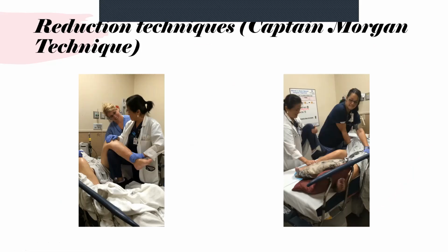And our A&E specialist here, I was actually supposed to put a name, but she's quite prolific on YouTube, and she does a lot of these things in the emergency department. Hopefully I'll look through and try to find the name again. We're going to look at something called the Captain Morgan technique, because you stand like Captain Morgan on the rum bottle. And I'm going to show you the video now.